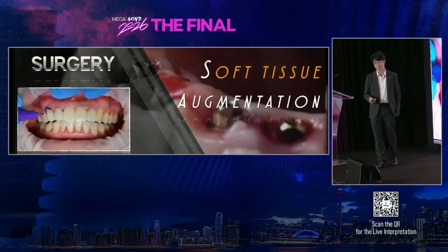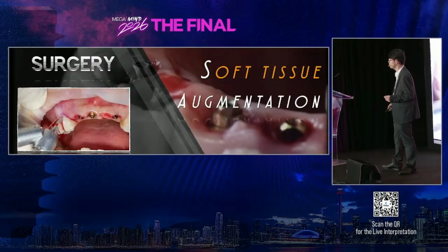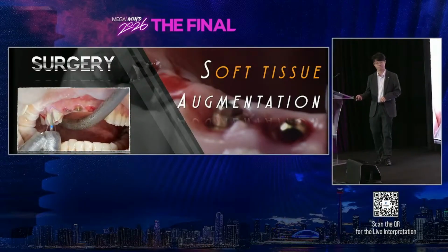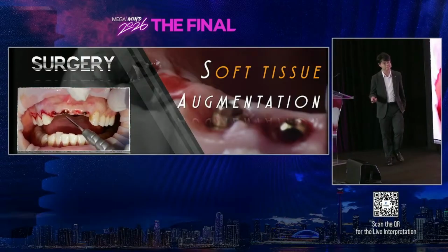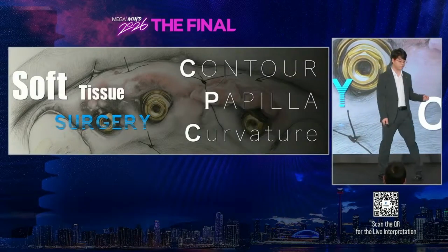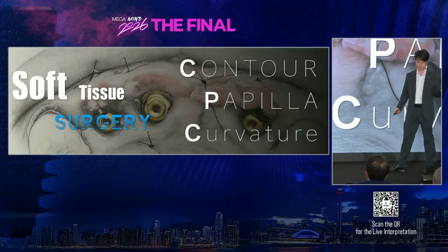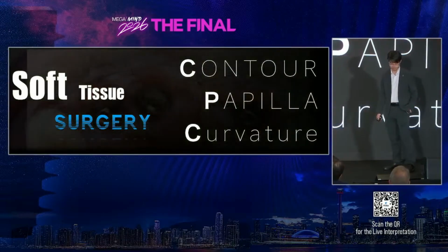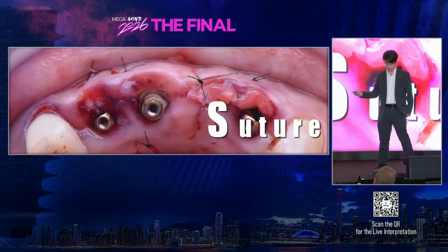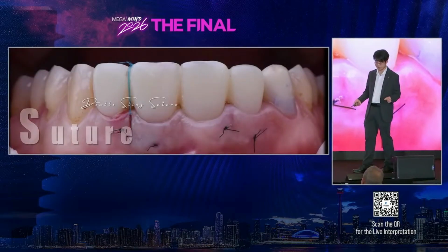And this is a protocol with surgery for soft tissue augmentation and crown lengthening, and we use a micro blade to do the tunnel technique. For the soft tissue augmentation, we need to consider the contour, the papilla, and the curvature. This is after suture. And on the left side, with the double sling suture.